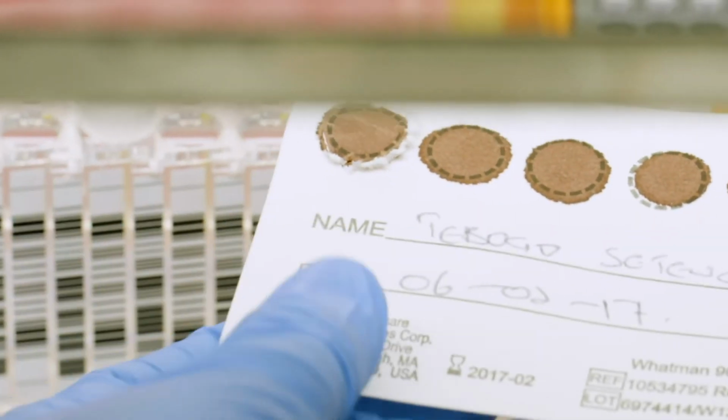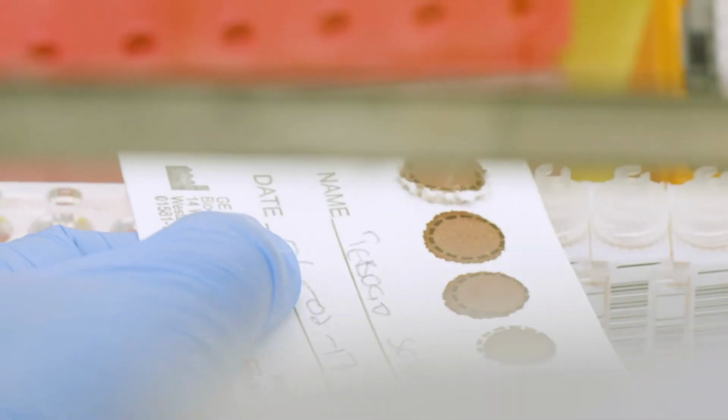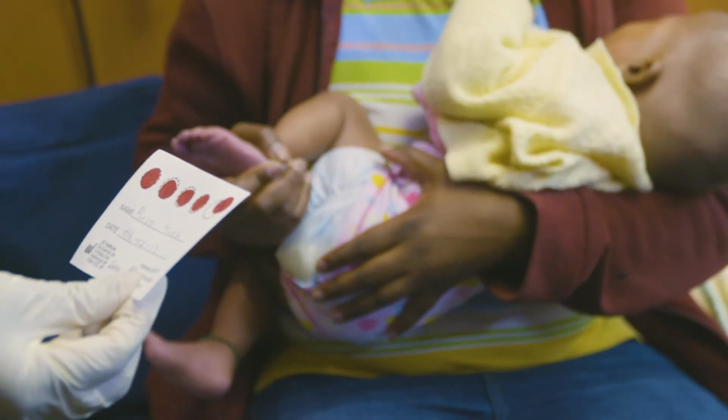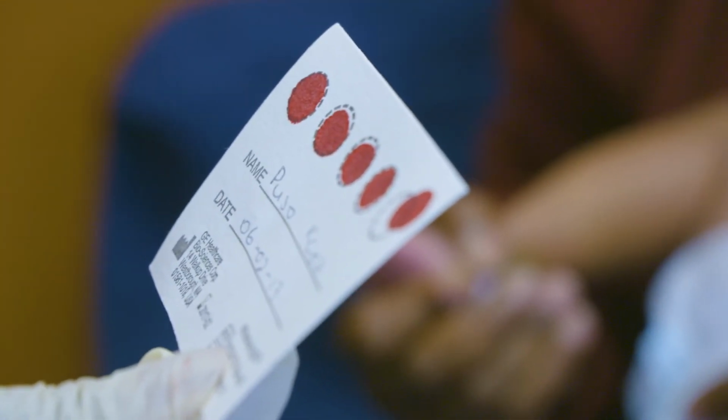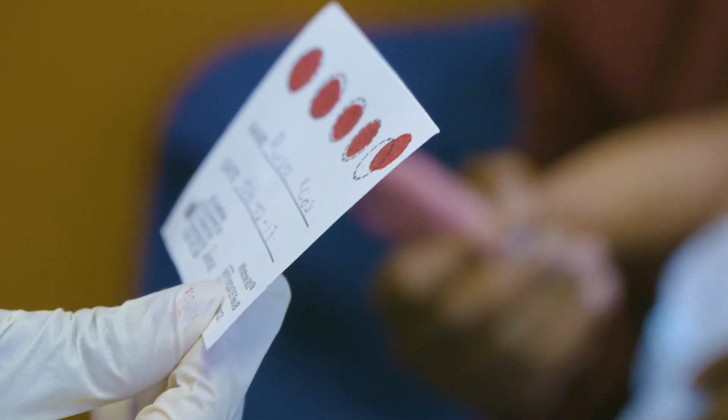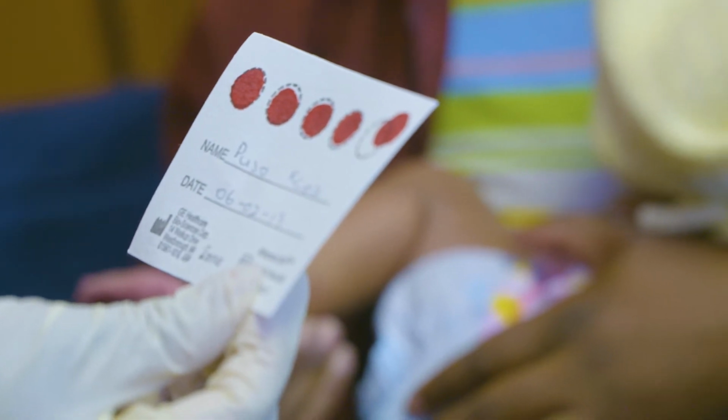We will review valid and invalid DBS cards in detail in a few minutes, but you may notice that, in this example, not all 5 spots are perfectly collected. However, at least 3 circles are properly filled, so this is a valid DBS card. Remember that filling 3 quality circles is better than 5 poor quality, half-filled circles.